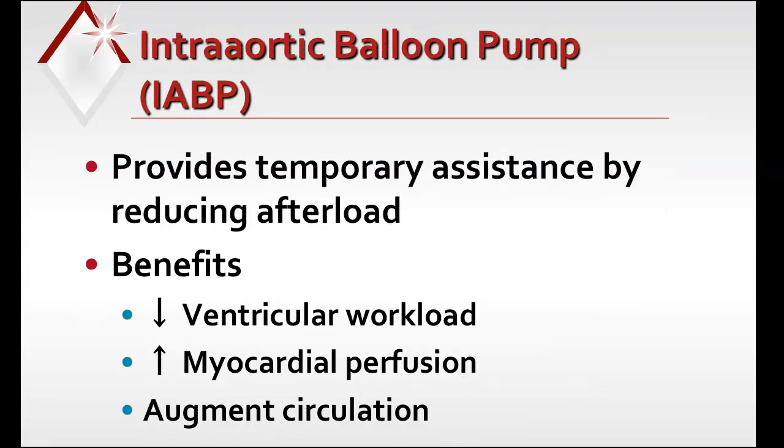All right, so let's talk about the intra-aortic balloon pump first. The balloon pump provides temporary circulatory assistance to the sick heart by reducing afterload, by reducing the systolic pressure, and augmenting the aortic diastolic pressure. And this is going to result in improved coronary blood flow.